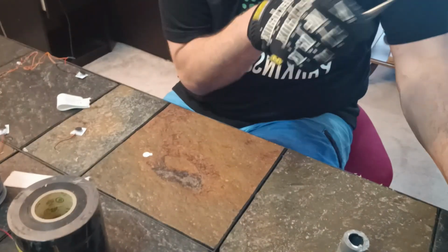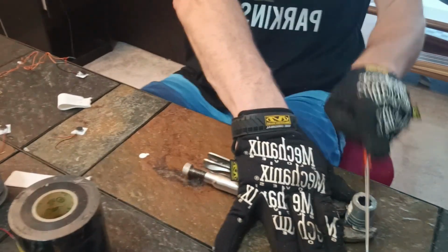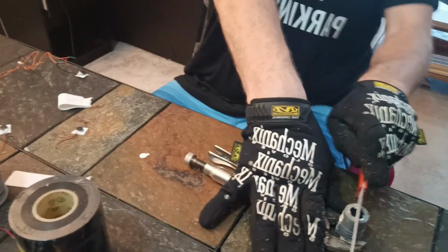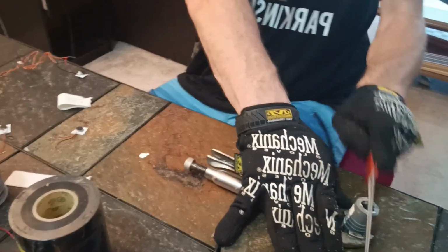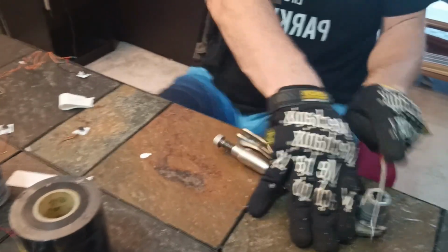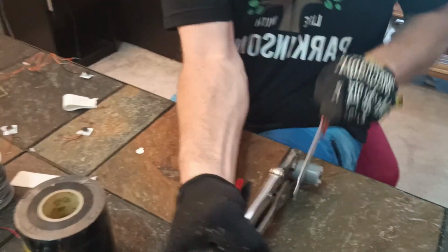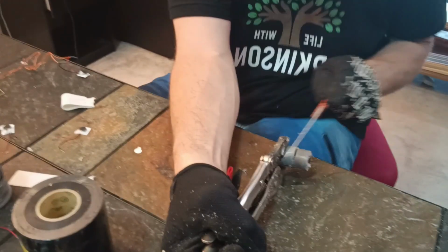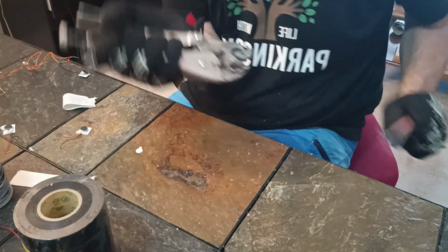Okay, next we do the down cut. So we're going to down cut, make a slot for the finger and a spot for the motor to go. Yes, confirmed. This is what we want. Okay, that is the cutting done.